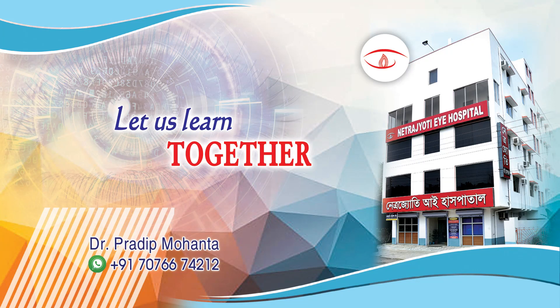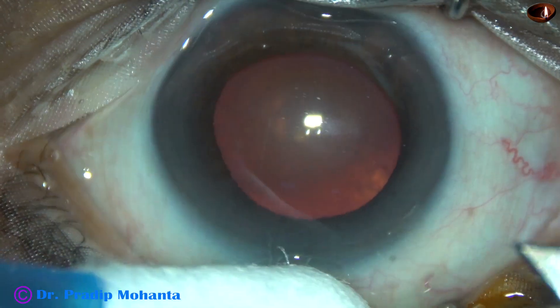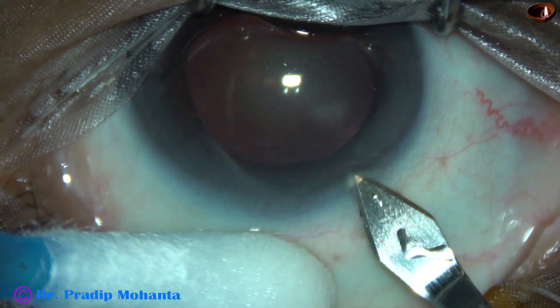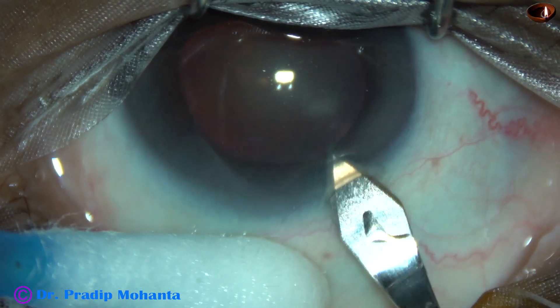Friends, welcome to my workplace at Ranagh Heart, West Bengal, India. This is a cataract with grade 3 nuclear sclerosis and the eye is deep-seated. Let us observe this surgery.